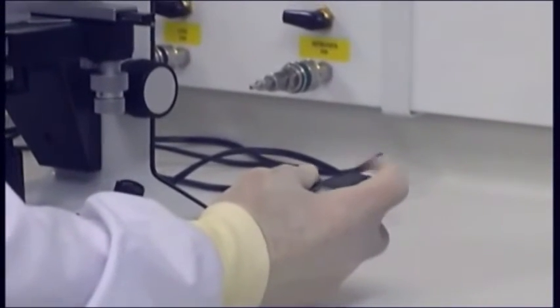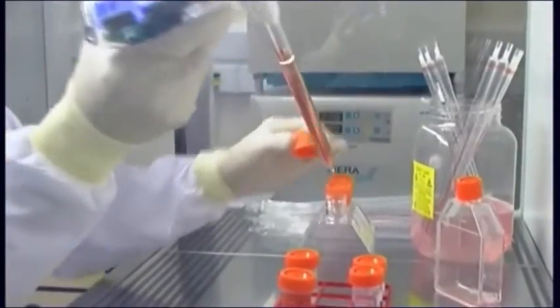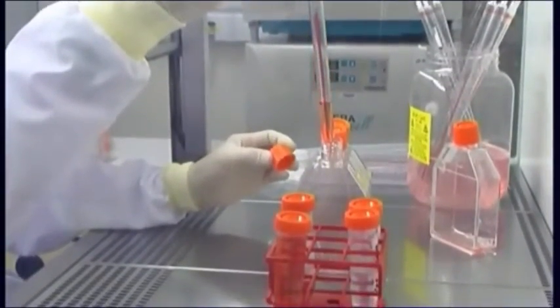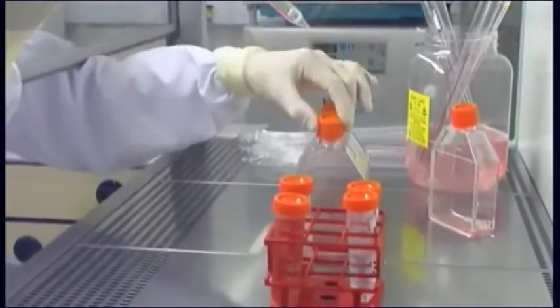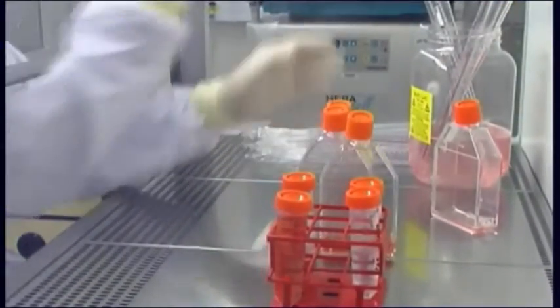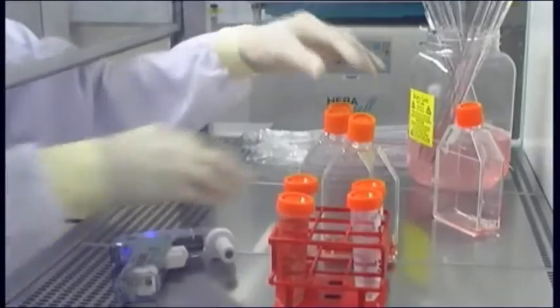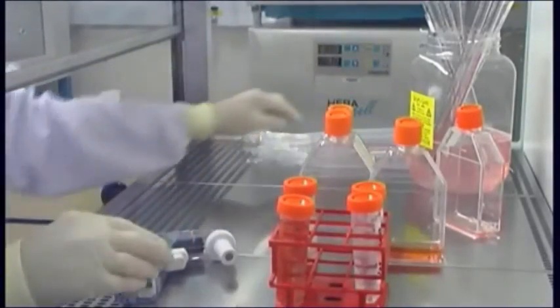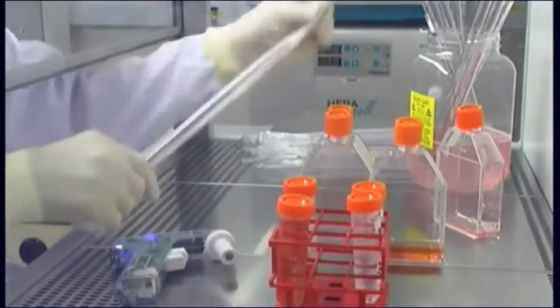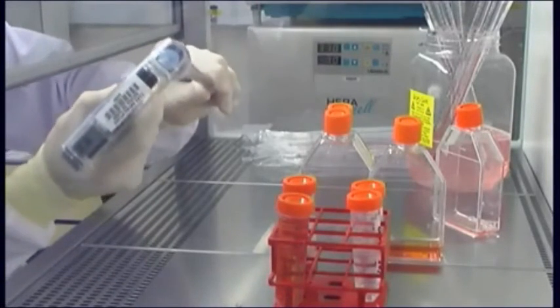Perform a cell count. Add fresh medium to dilute the cells out to the required seeding density. In some cases it may be necessary to centrifuge the cells into a pellet and resuspend the cells in entirely fresh medium. Aliquot into new flasks as required.